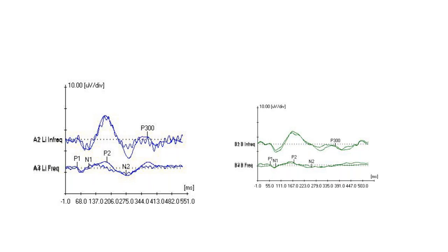And the next question is, ma'am, does the type of processor really influence the potentials, off the ear and at ear level? I think there are a lot of questions with the cochlear implant. There are studies which show that depending on the type of processor, the artifacts you get are different. With reference to the further part of it, is it off the ear or on the ear? That I don't think should make a difference, because in any case, if I'm doing it with CI, I always recommend doing it with the contralateral mastoid. If you're doing binaural, where you want to test with both implants on, then it's going to be a little tricky. Otherwise, we normally choose the contralateral mastoid, so artifacts are lesser.